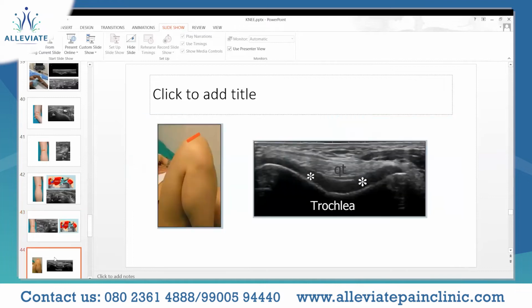Okay, so the final slide. The application in knee scan would not be complete if you could not mention the articular cartilage. Here you can see that the knee is completely flexed, almost up to 130 to 135 degrees, wherein you place the probe just above the patella. The patella translates inferiorly along with the quadriceps muscle.